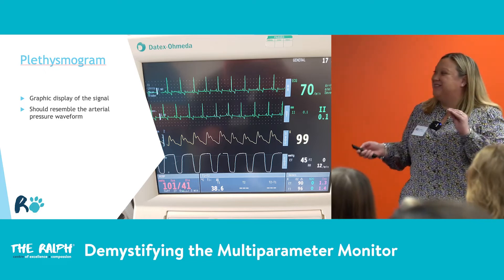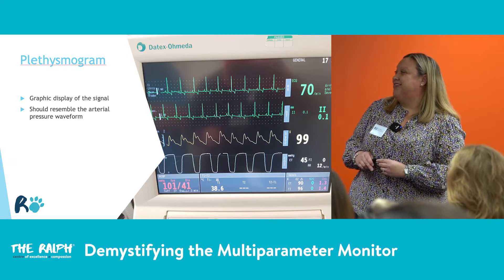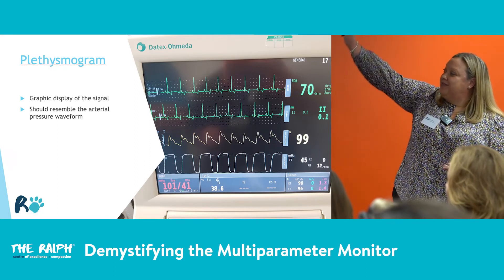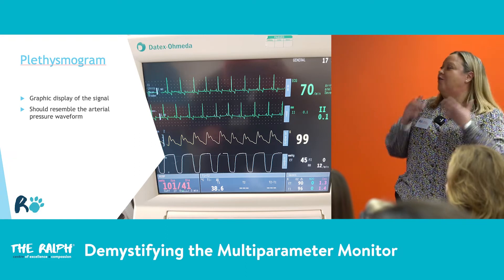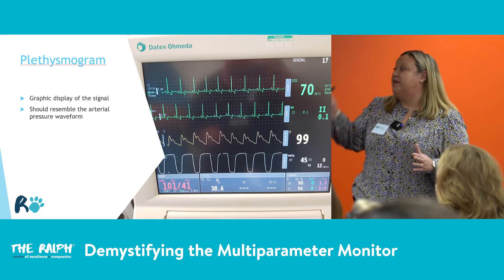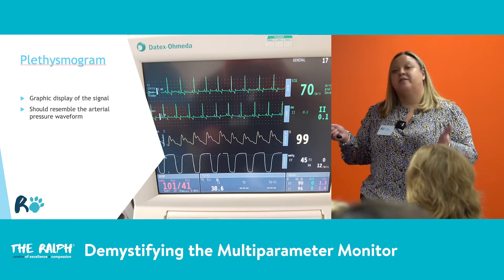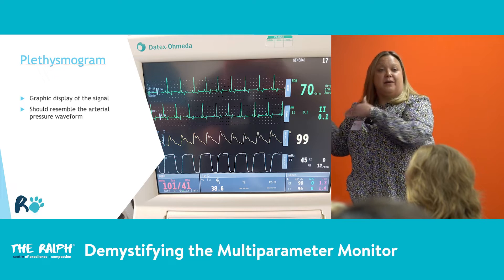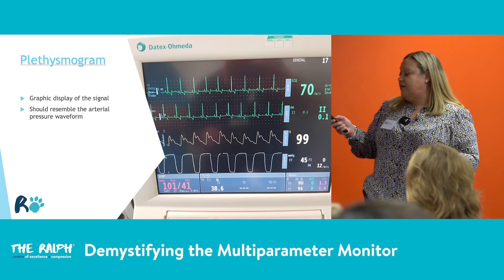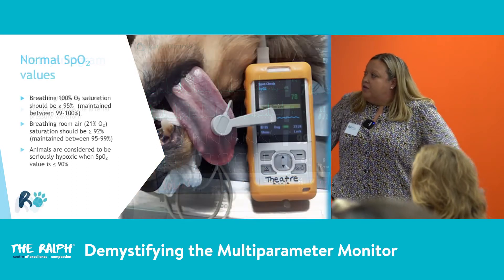This slide is again explaining what I've just said. This is a beautiful example of a nice pulse ox trace and a nice ECG — everything's working correctly. I'm going to trust that, because people say you shouldn't trust your machines, but I know that machine's working well and it's telling me information. I use all my other sensors alongside it to run with that.